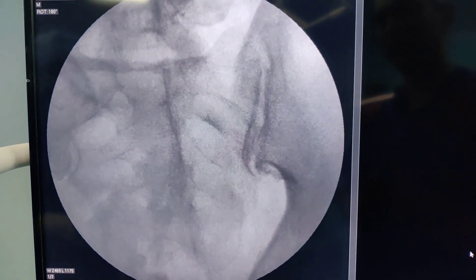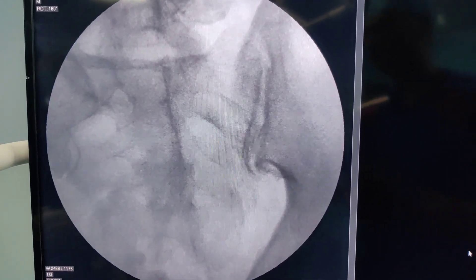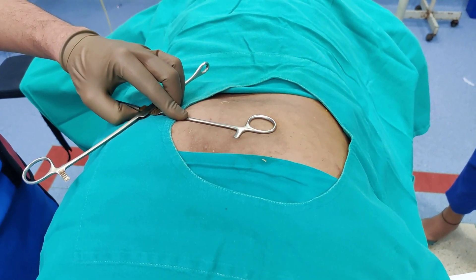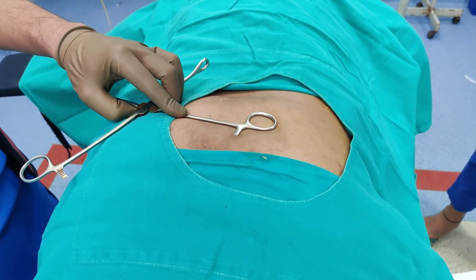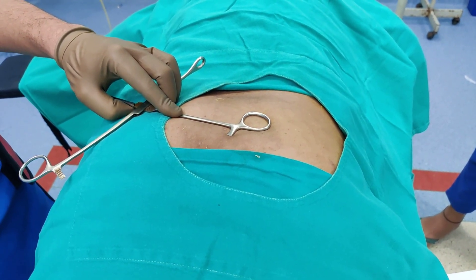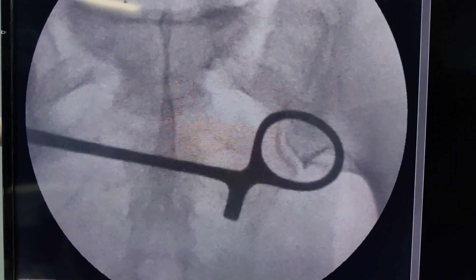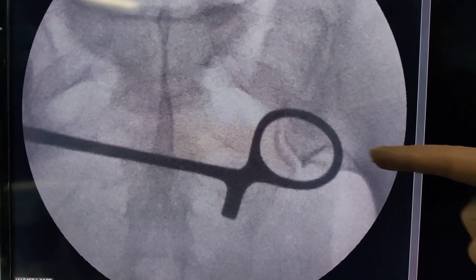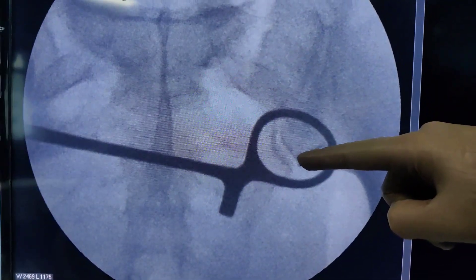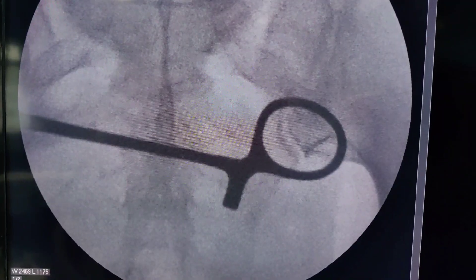I am using the edge or handle of the sponge holder to localize the inferior aspect of the sacroiliac joint. I have taken a shot — this is what you want to see, because our needle is going to enter from the inferior aspect. This is our main area of focus. Once I have localized it, I am going to mark it with a marking pen.